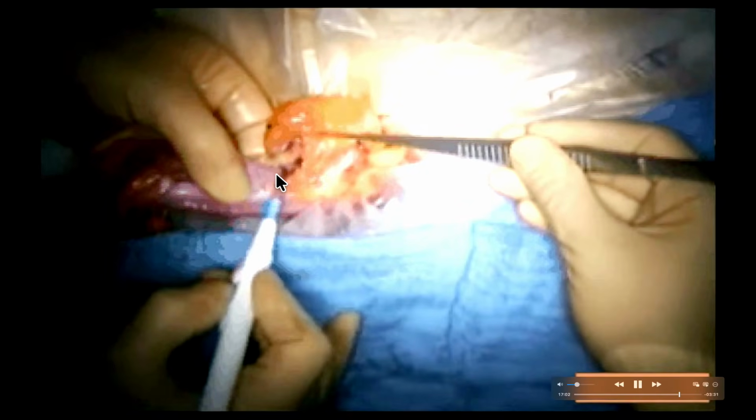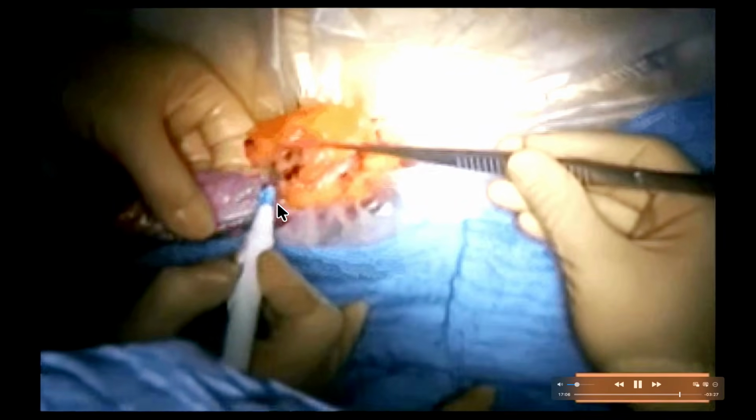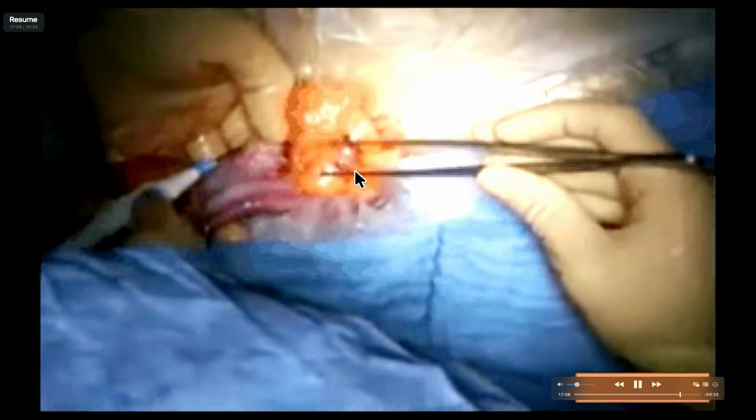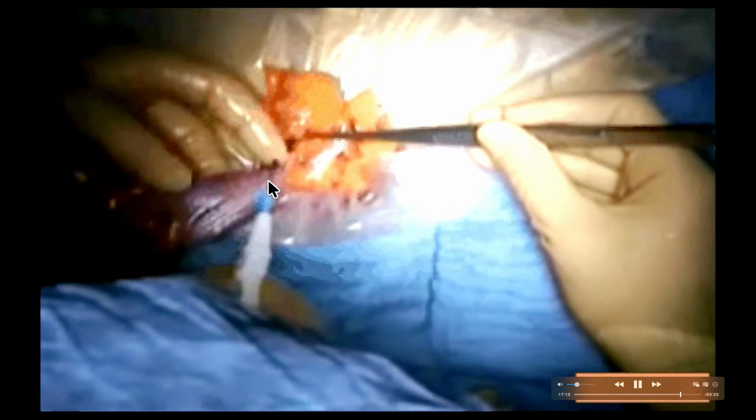Once it is shaved, there is a beautiful instrument called the purse string applicator. This is sigmoid, this is descending colon. And all this fat is shaved carefully so that the serosa does not burn.